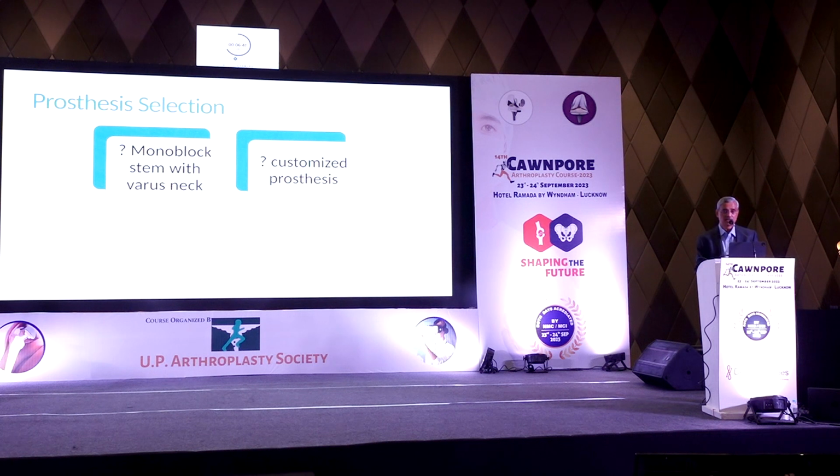So prosthesis selection, in the earlier days, we had not much of choice. We just had a monoblock. We had to get done with it. Most of the times we struggled with this. Nowadays, you have the modular hips.